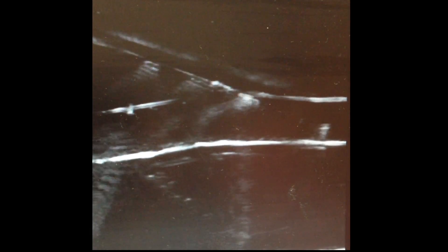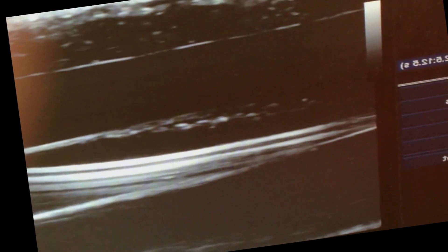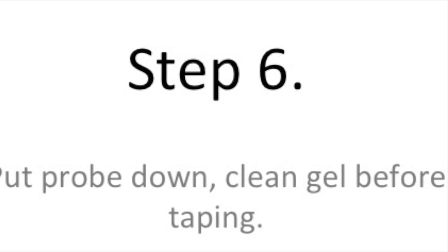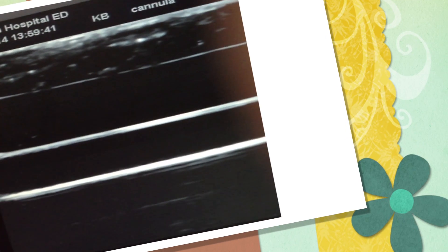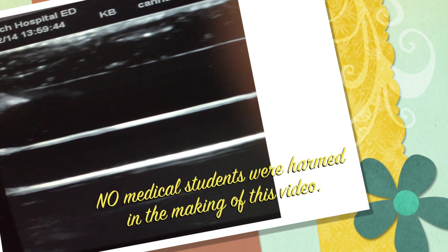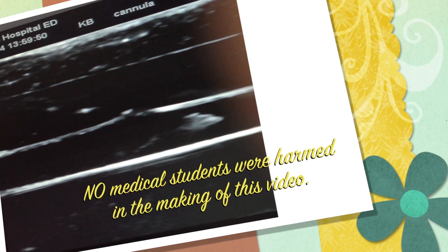Slide the cannula off and watch the back wall. This particular cannula is much fresher so it has more air in it — it's easier to see. At this point, put the probe down somewhere safe. Clean the gel meticulously off the patient before you start to stick anything down. Clean the probe. Return the machine and plug it in to recharge the batteries. Please practice these techniques — they'll stand you in good stead with any other needling techniques, and I'd rather you practiced on peripheral veins before you start on central lines.